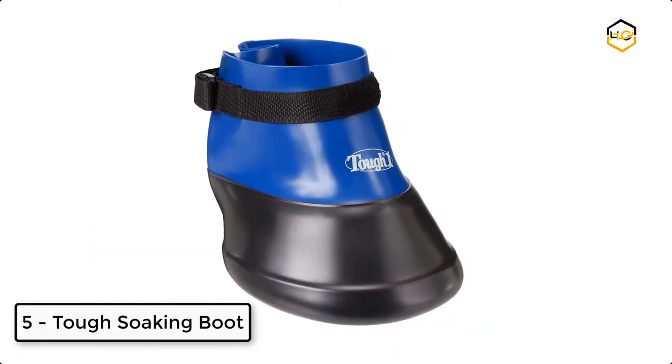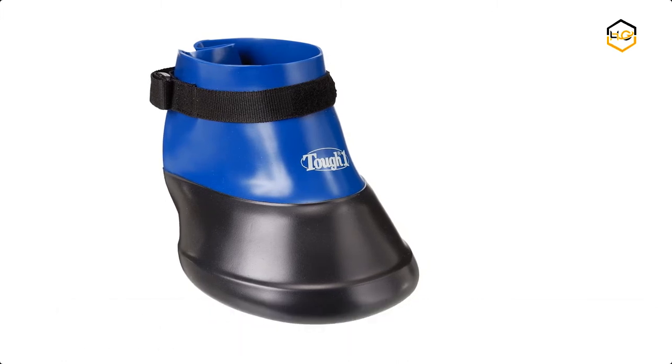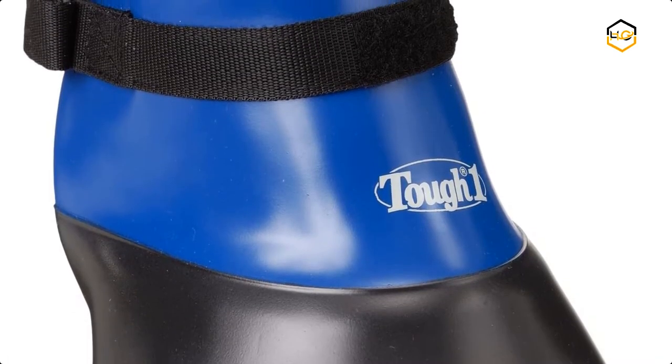At number 5, we have the Tough Soaking Boot. It eliminates wrapping and promotes healing, and holds medication while conditioning the foot.